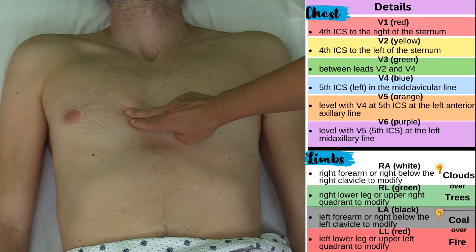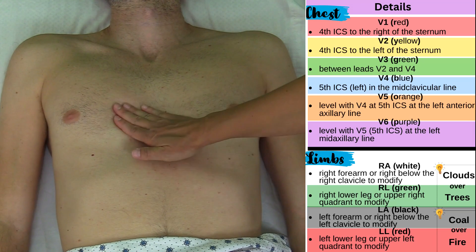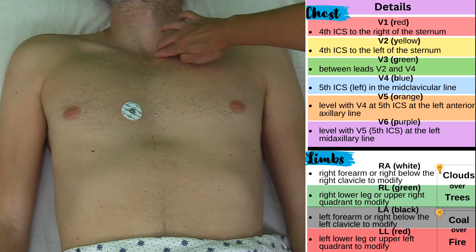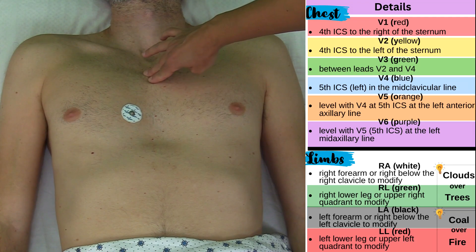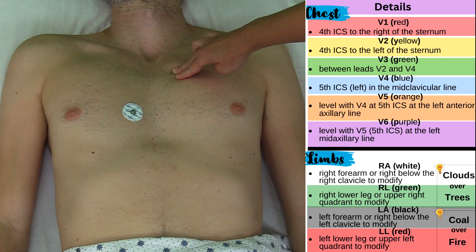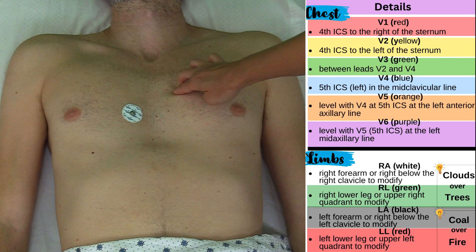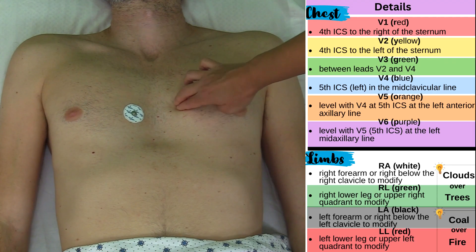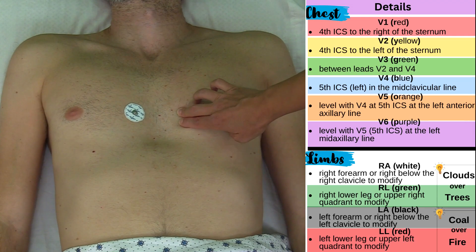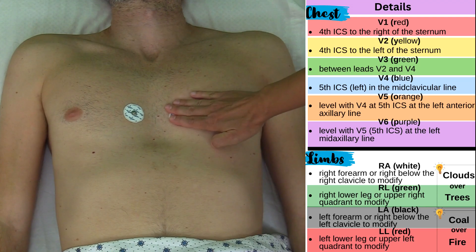This is where I want to go, just right to the sternum — not on the sternum — and this is where V1 is going to go. So I'm going to place it right here. Next is V2 and I'm going to follow that same procedure again: find my notch, go down to my angle of Lewis, go over to the left this time — that's my second rib. Go down through the second intercostal space, third intercostal space, fourth intercostal space, and I'm left of the sternum, level with V1. So I'm going to place it right here.